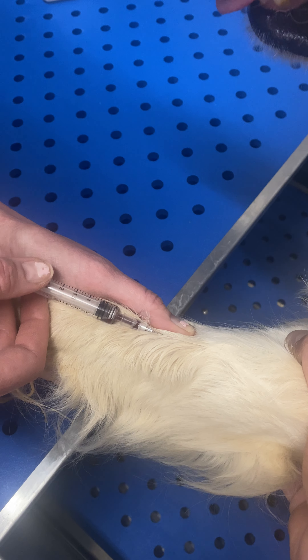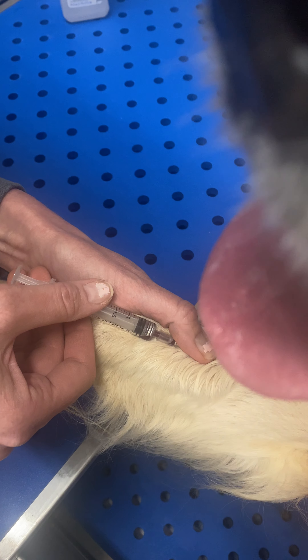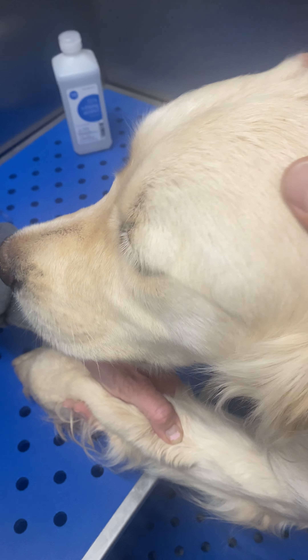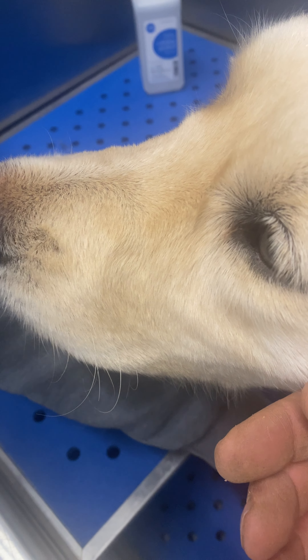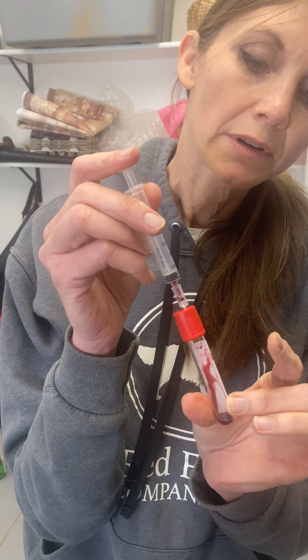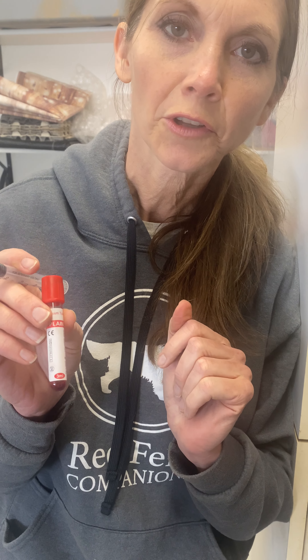I'm not going to take too much from her because I don't need any. As soon as you draw your blood — your amount of blood — you're going to put your thumb on there and draw that out. You can release that. I'm just going to hold some pressure on that to keep it from bleeding. Then we take the blood in the syringe, stick it into your blood tube, and it will automatically suck it right out. Push the rest of that blood in. Then you'll want to label your tube.